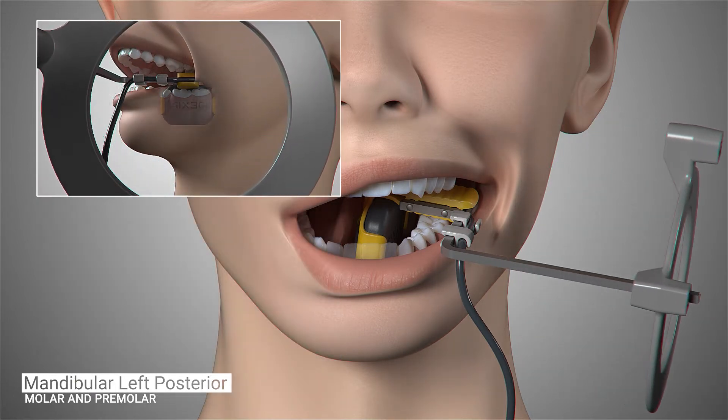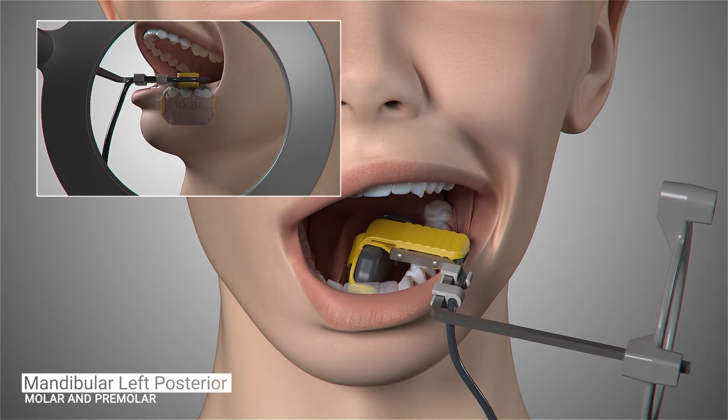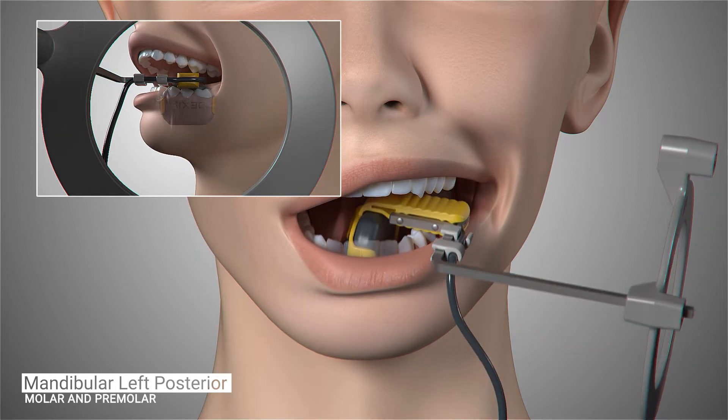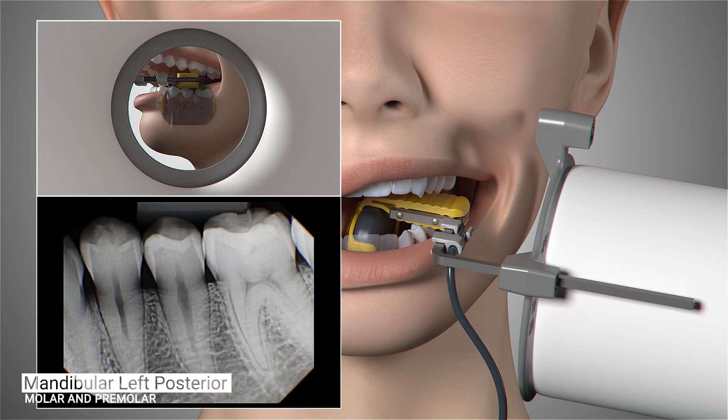Ask the patient to open slightly and gently slide the sensor forward, centering the first and second premolars on the sensor. Place the x-ray cone flush with the aiming ring and trigger your exposure. The image should contain the distal of the canine through the mesial of the second molar.